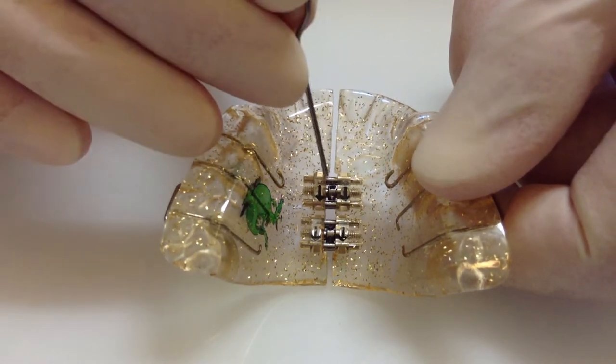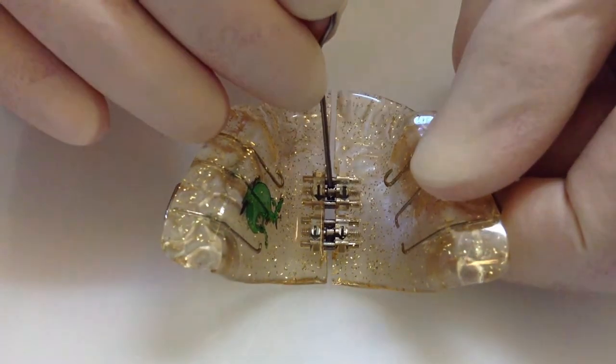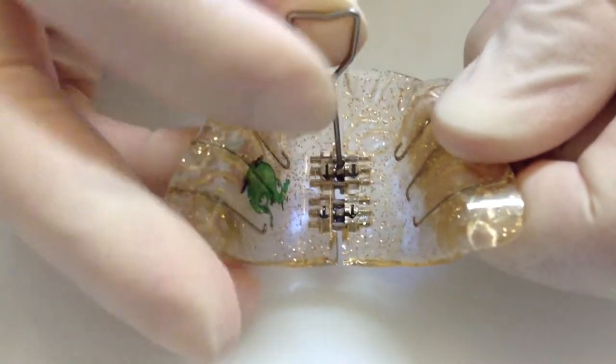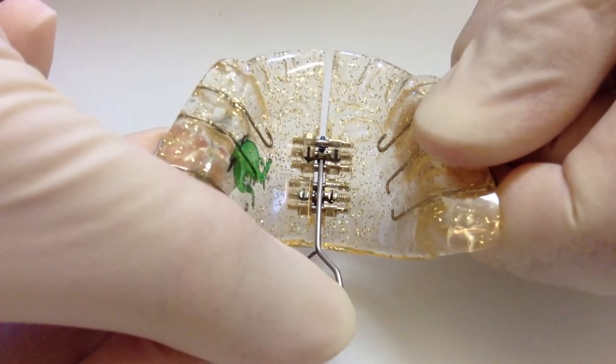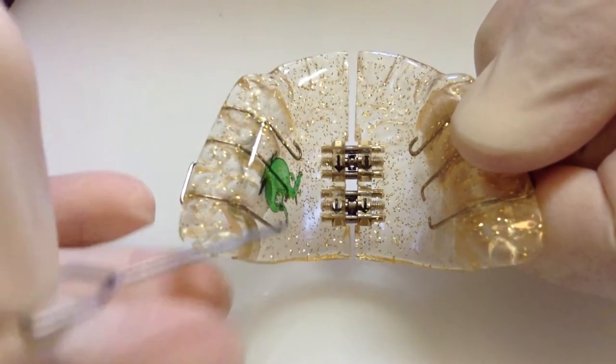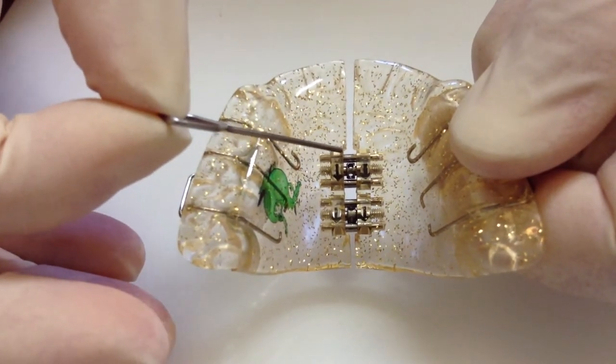There's a small hole here that you'd like to place your key into, and then turn in the direction of the arrows until you can't turn any further. Then just remove the key just like that. You should be able to see the next hole there.